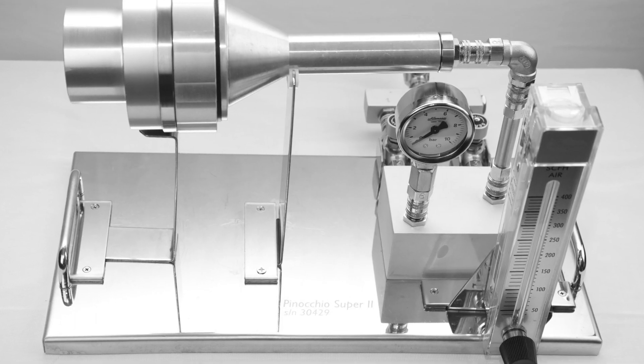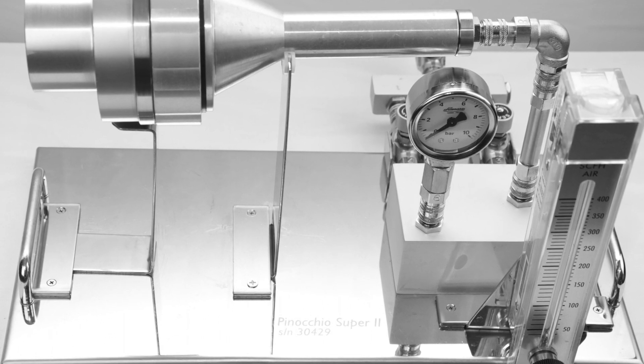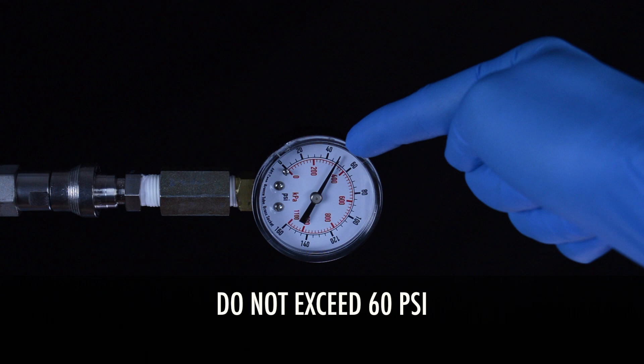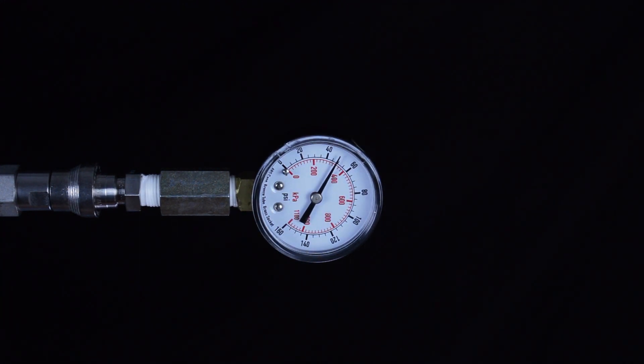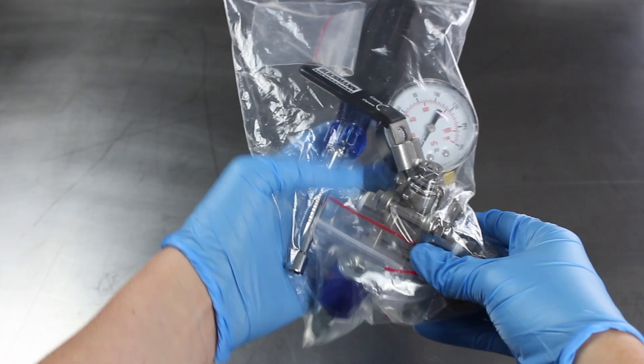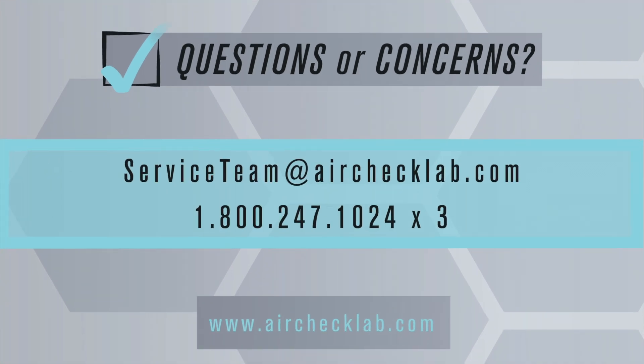The Pinocchio Super 2 compressed air sampler is validated at 100 liters per minute for 10 minutes of use. Once the sampling point purge is complete, you will need to regulate the pressure to no more than 60 psi. We have provided accessories including a pressure gauge, control valve, quick disconnects, clamps, and barbs. Now you're ready to put together your Pinocchio sampler.